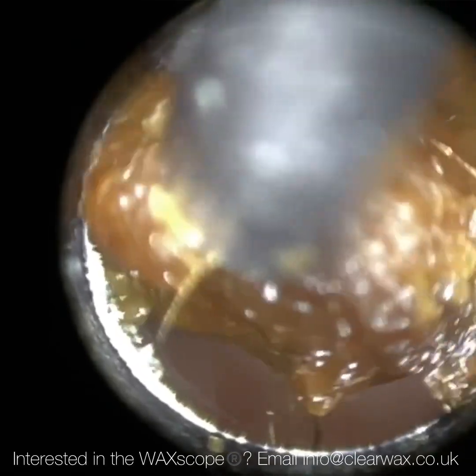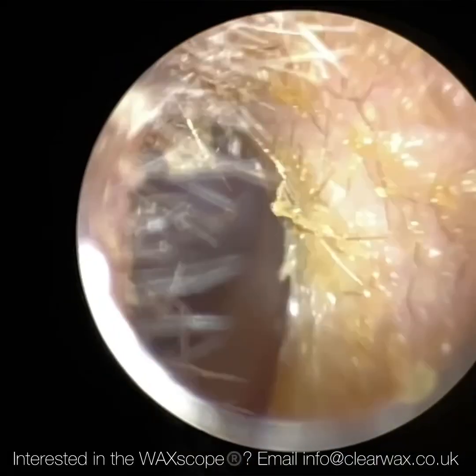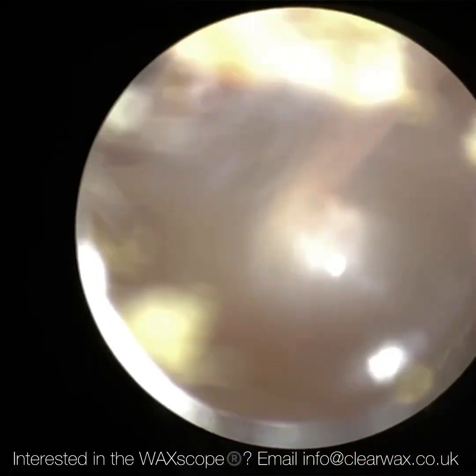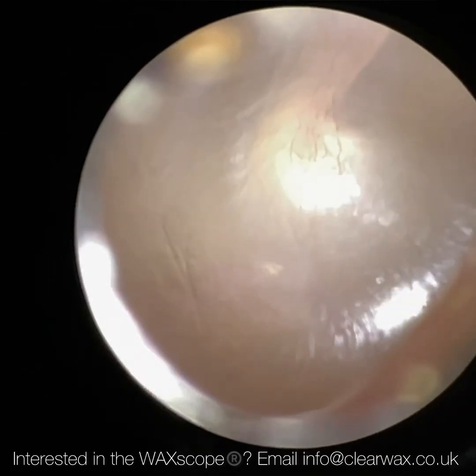However, there are some cases where I use the Waxscope in preference over the endoscope, particularly children who are not able to stay very still. It really helps you to stabilize the patient, because with an endoscope you don't have a speculum.